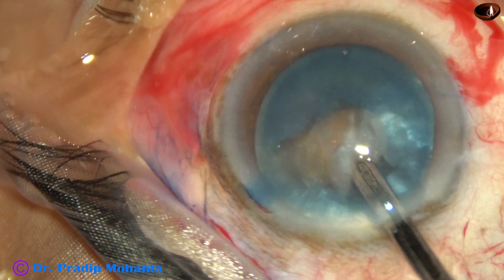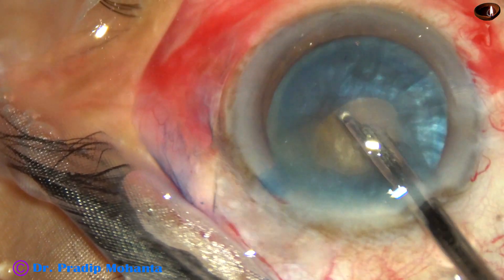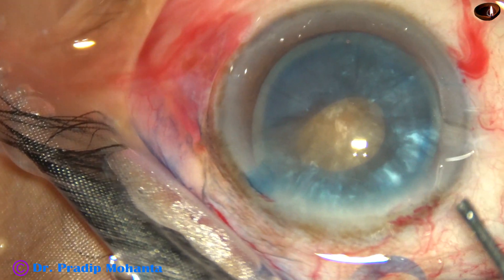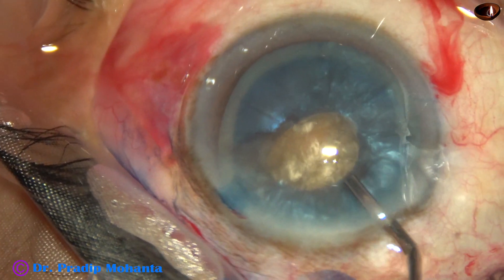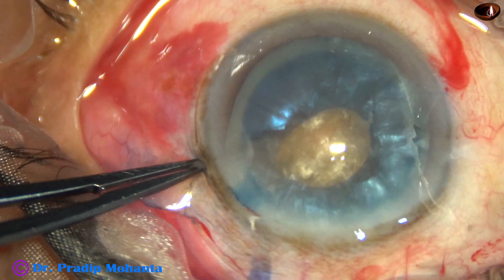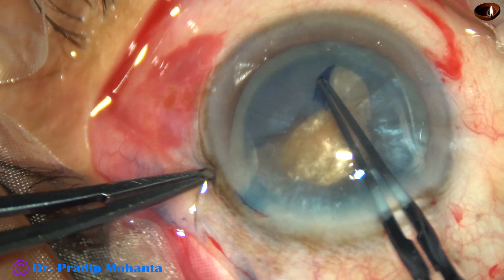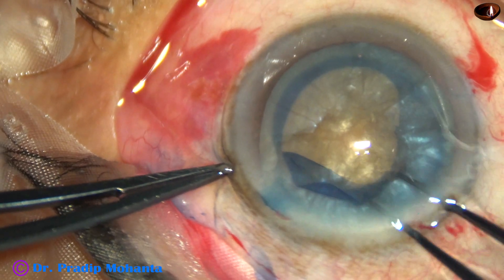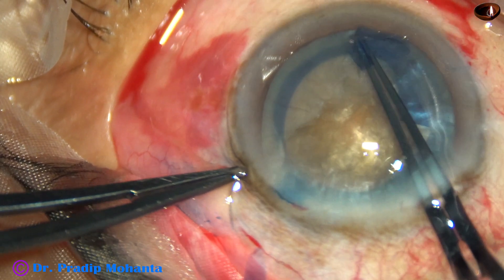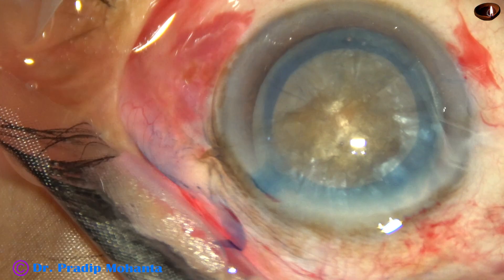Gently rotating the nucleus. And again, another big chunk of cortex came out. This is another one. This is a huge nucleus, and a lot of cortex have been hydrated, increasing the intralenticular pressure. Now, after injecting viscoelastic, I make an oblique cut at around 8 o'clock. Use the utrata forceps again and go all around anticlockwise. At this time, I try to make the rhexis large and round, as round as possible. And this has been a very satisfactory rhexis.